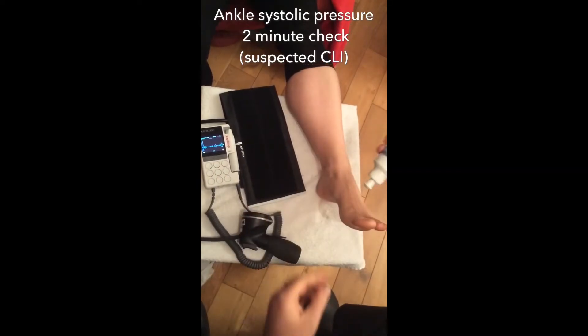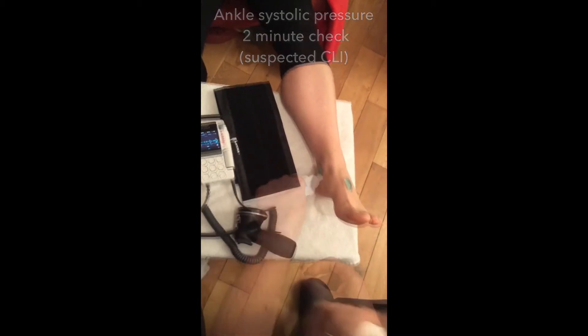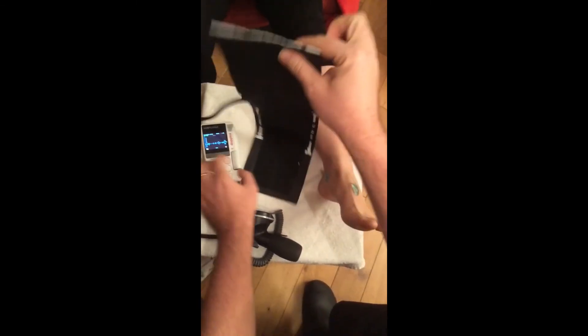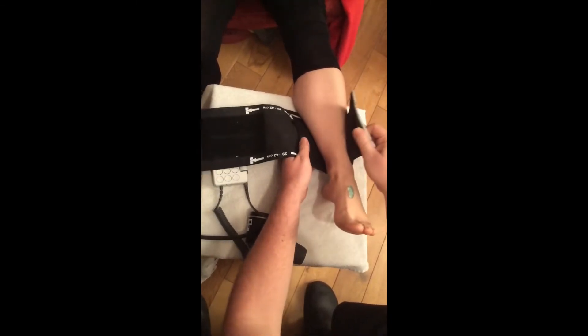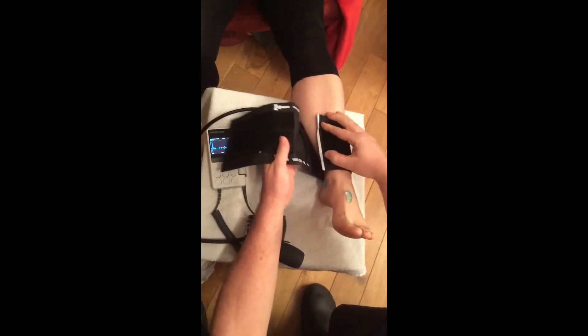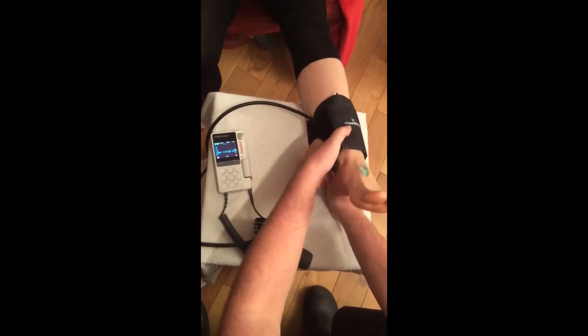Put some ultrasound gel over the two main arteries of the foot. Parallel wrap the sphygmomanometer cuff around the lower part of the leg, just above the malleoli, taking care not to trap the tubing underneath the leg.